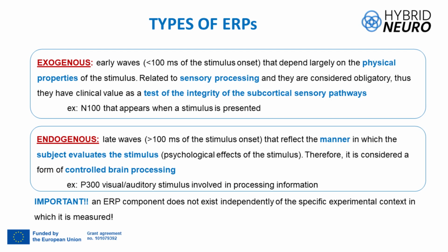And we don't have to forget that the potentials are affected not only by the experiment but the whole environment or other things additional to the experiment.